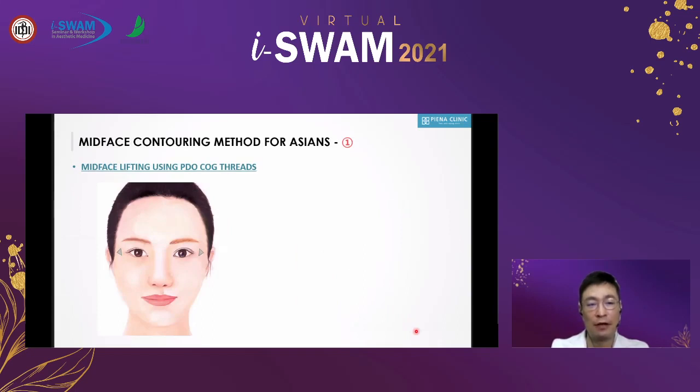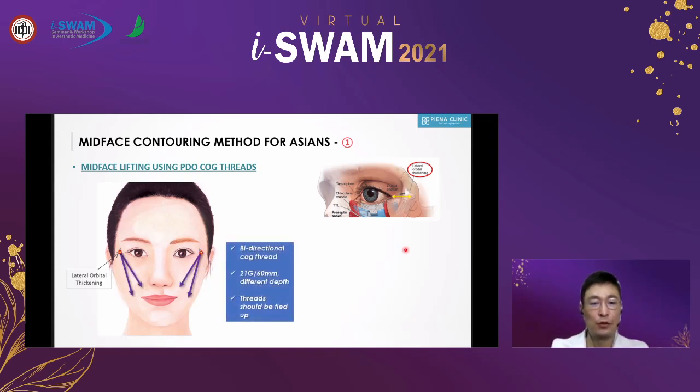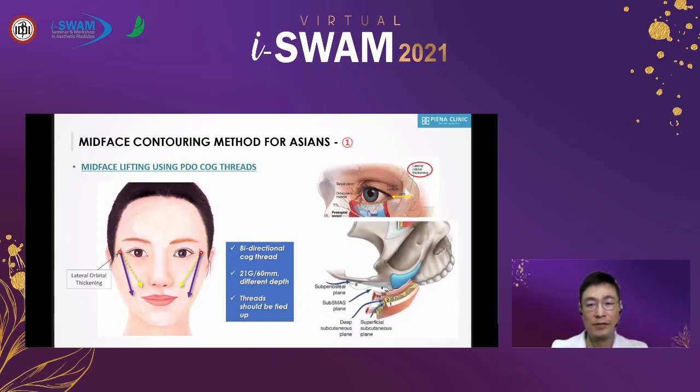To use this direction, it's quite difficult when you want to begin from the hairline. So I would rather recommend using this thick anatomical structure. It's located 2 centimeters lateral to the lateral canthus. And put shorter bidirectional cog threads. And then if you tie them up at this area, you can create a very strong lifting effect without widening of the zygoma.